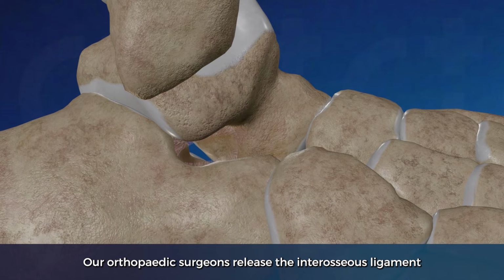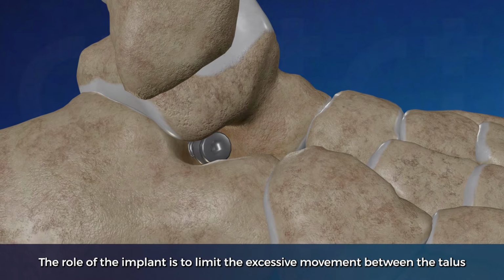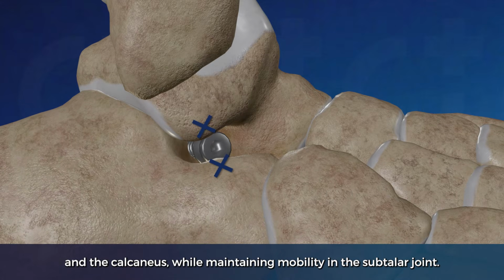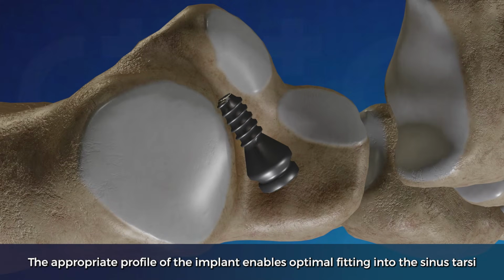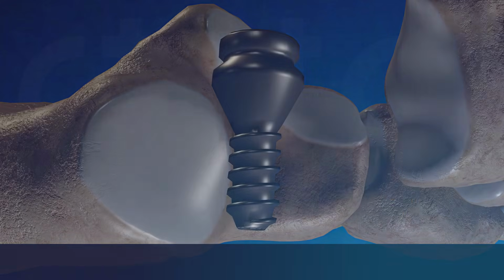Our orthopedic surgeons release the interosseous ligament to allow the implant to be properly placed in the sinus tarsi. The role of the implant is to limit the excessive movement between the talus and the calcaneus while maintaining mobility in the subtalar joint. The appropriate profile of the implant enables optimal fitting into the sinus tarsi. Our orthopedists use only proven models of the implants.